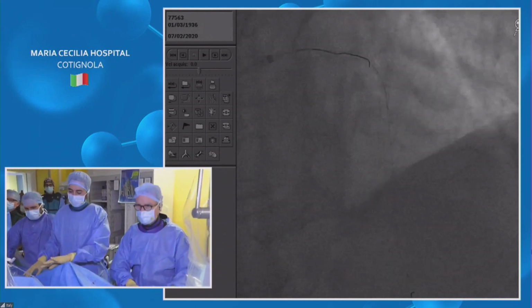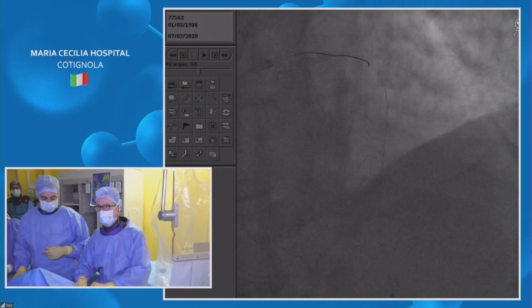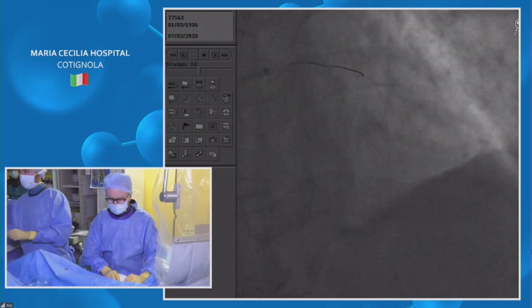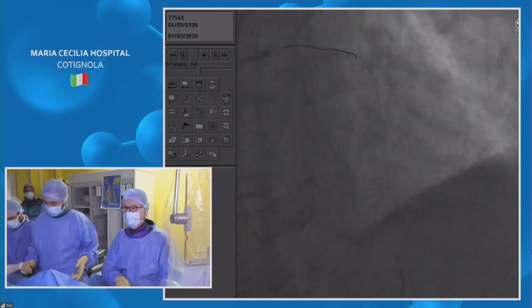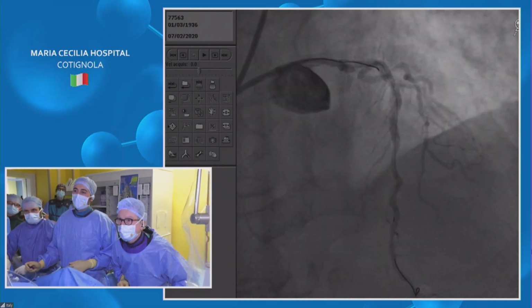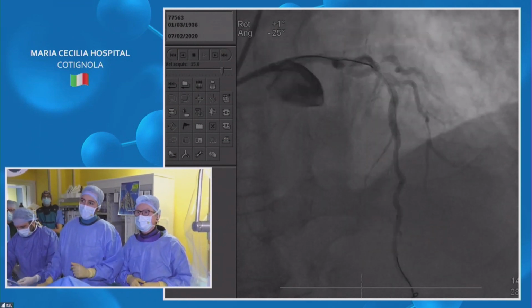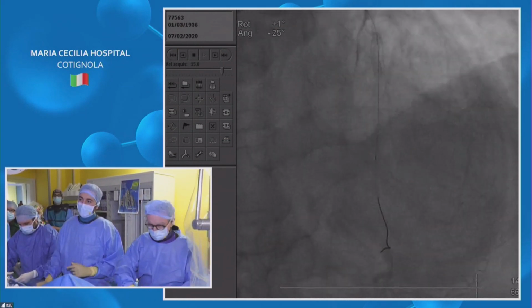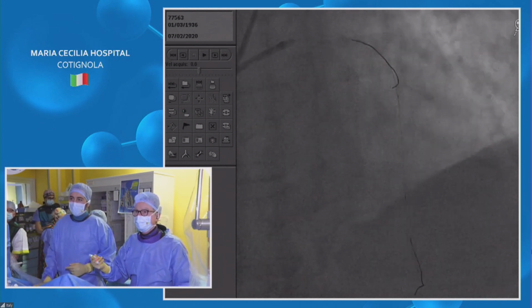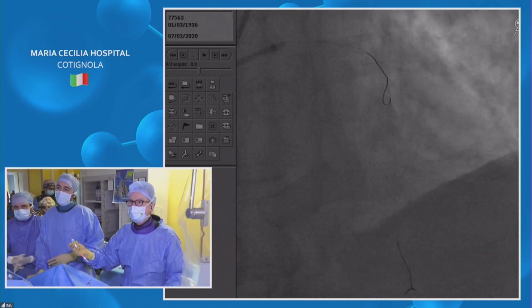Creatinine is fine, so we can take pictures in a relatively liberal fashion. So the stent has been reasonably well deployed. Let's take a picture. The stented area looks fine. Of course, there is disease proximal to that, yes. But let's see by pressure. So angiographically, we will be very happy. So let's see what the pressure shows, yes.